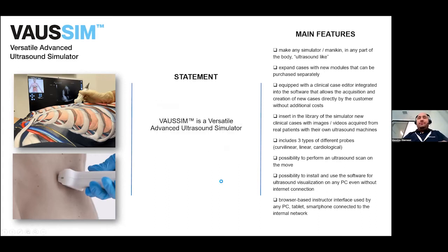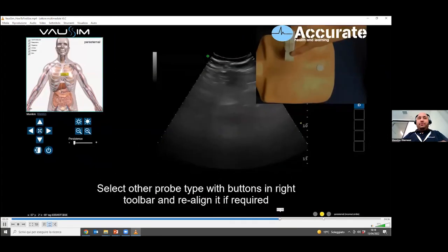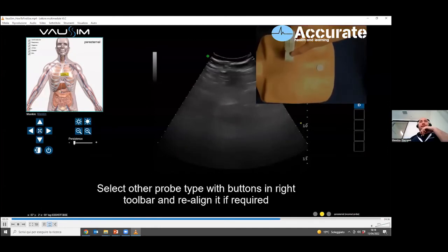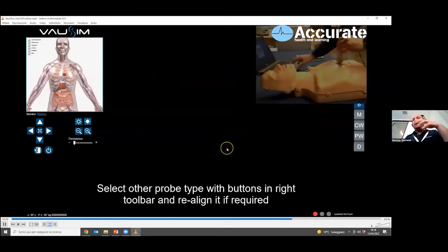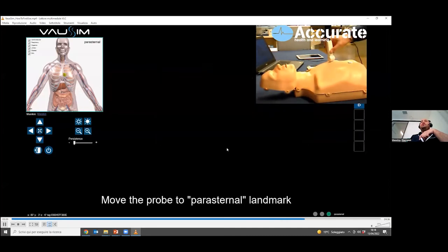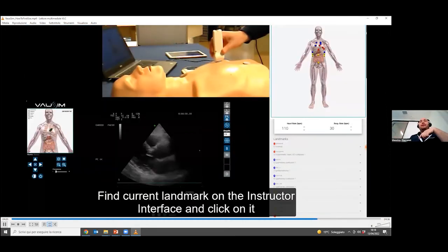Now, we don't see the whole video, just a small part of it. Let me switch off the audio. I wanted you to see, for example, the interface. This is the user interface that you have in the middle. You have the ultrasound view, like in a real ultrasound machine. We have, in a picture-in-picture, a very simple mannequin where we put sensors on top, and just by switching from one point to another, you can see how the different volumes load, and you can see how the different situations can change.